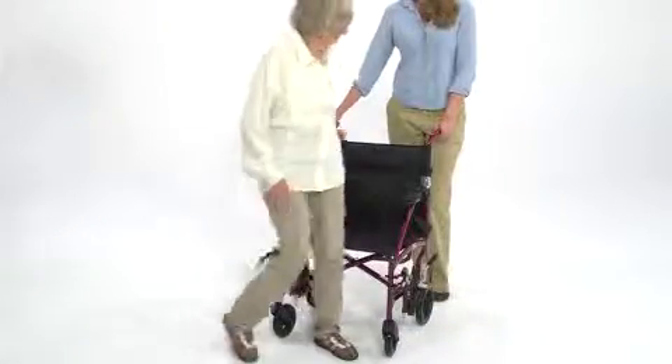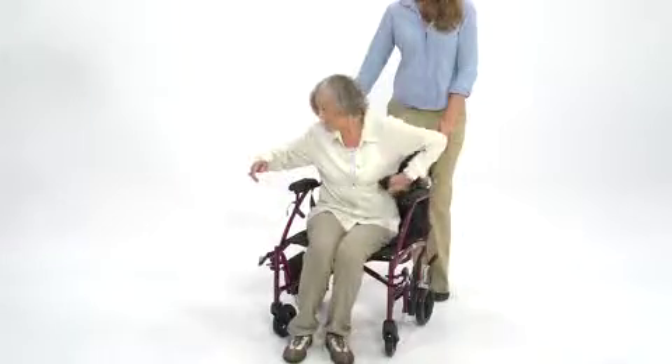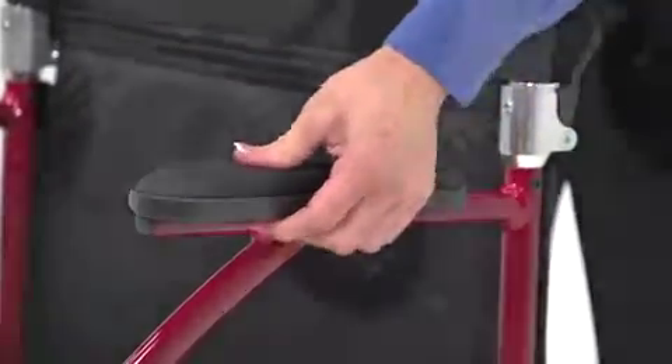The chair's sturdy frame and durable material supports up to 300 pounds, and a built-in seatbelt enhances passenger safety. The chair's nylon upholstery is breathable and easy to clean, and the armrests are padded for comfort.